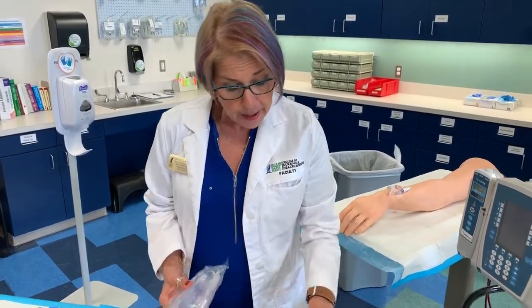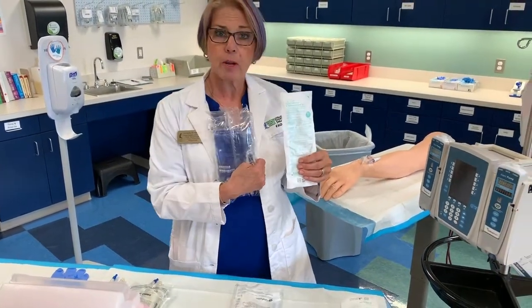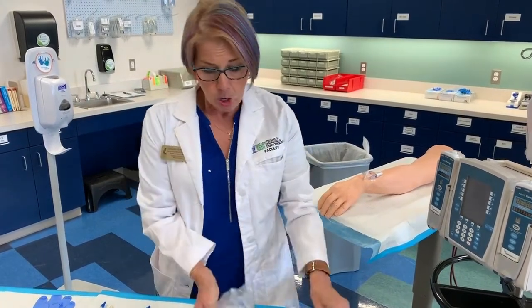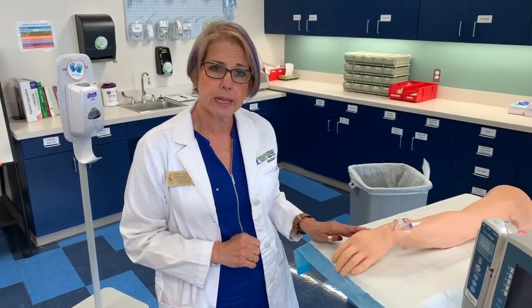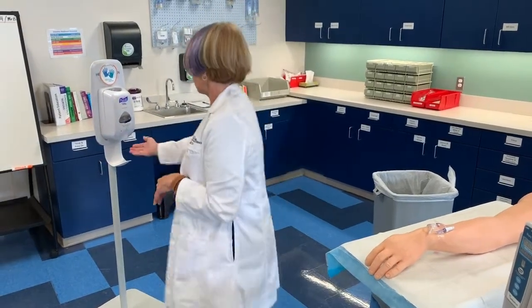So when I gather my supplies, I've got my IV administration tubing and I've got my normal saline, and we're going to start with the 500 milliliter bag. So as we get started, we're going to make sure that we've identified our patient properly, that we've explained to them what we're doing, and let them know we're starting IV fluids. And then next, we're going to perform hand hygiene.